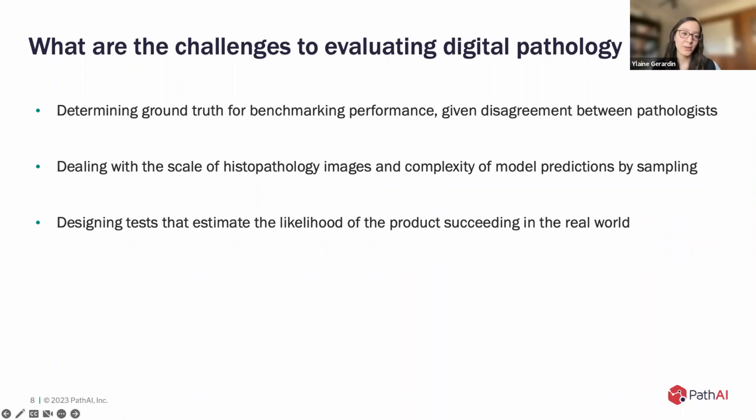And then finally, how do we design tests of our models so that we can estimate the likelihood of the product succeeding in the real world? Because at the end of the day, that's what we really want to feel confident about: when we apply these digital pathology products to a new situation, that it's going to perform well, and that our test set is going to be informative of how well it's performing in the real world.